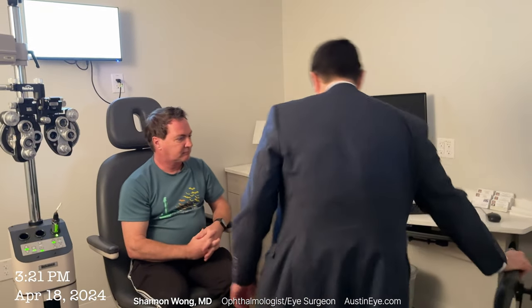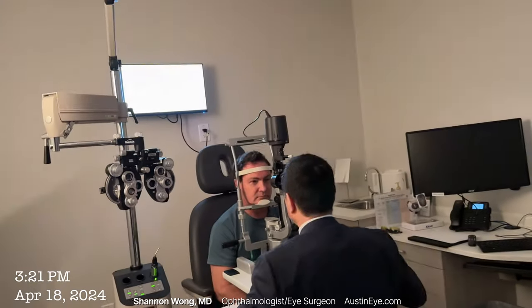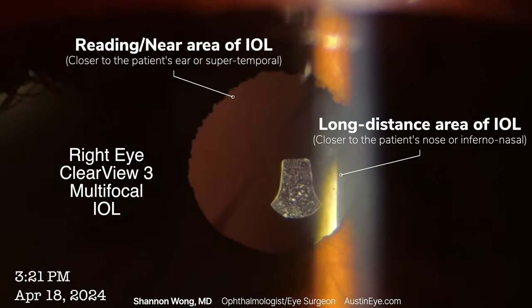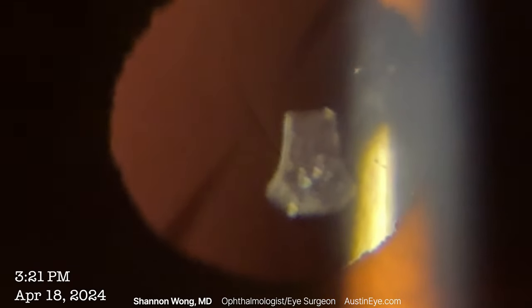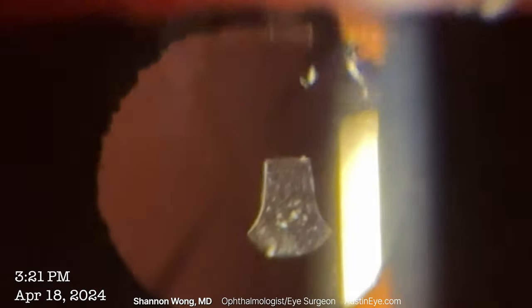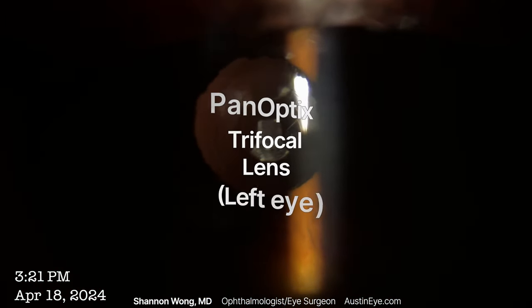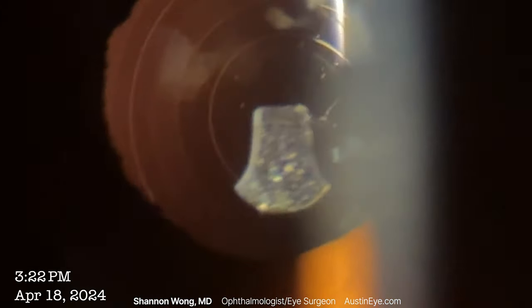Let's see how you look through the microscope. There is that little segmented area in retro illumination. The distance part is at roughly 2 to 8 o'clock, the distance area is there and the near area is there. Sliding over to the Panoptix eye — retro illumination of a Panoptix lens. So you see a halo from your left eye and don't see one from your right, because of the design of the lens.